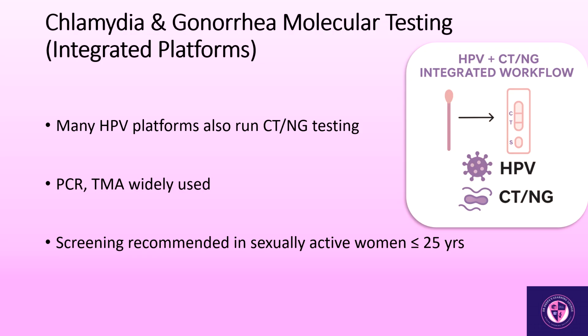Chlamydia screening is recommended for all sexually active women under 25, or older women with risk factors. Gonorrhea is often co-tested because co-infection is very common. These integrated systems increase efficiency while ensuring high clinical sensitivity and reproducibility.